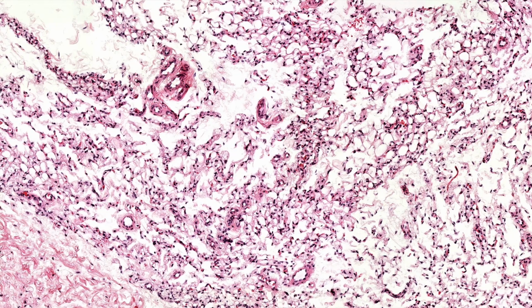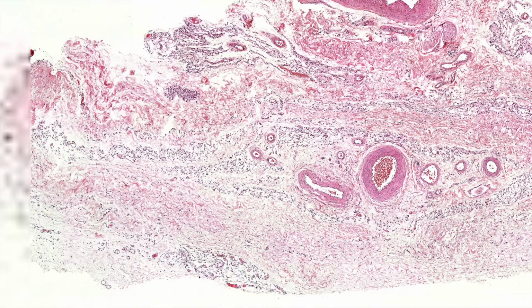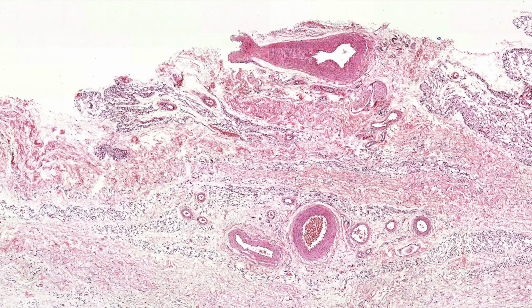The reason that's important is because, like I said, it could mimic carcinoma. It could mimic a liposarcoma if you're having a bad day. It could just cause you confusion as to what the heck is going on here. So why does lipoatrophy happen? What are some causes of lipoatrophy, fat atrophy?